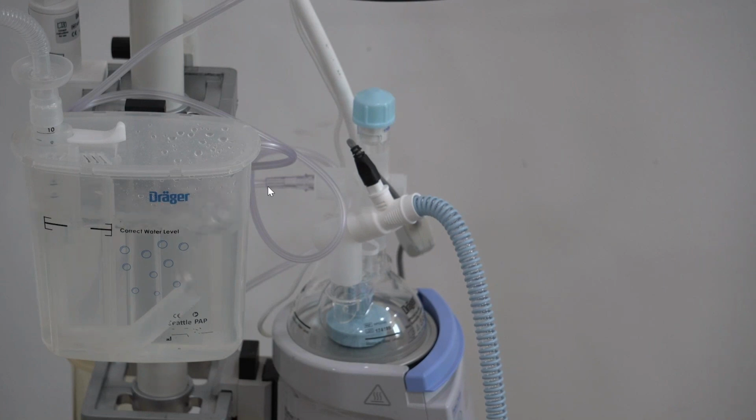Okay, I think the next question we already mentioned. How often do we need to change the ventilator circuit? And the circuit, we already mentioned, is required to be changed every 7 days. So that is the factory default requirement.